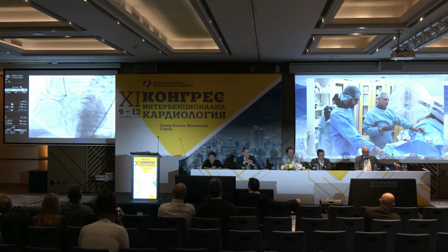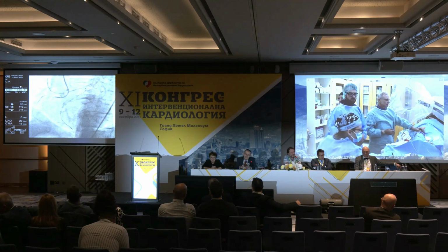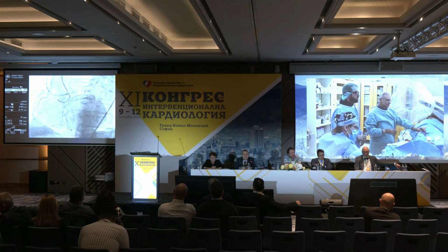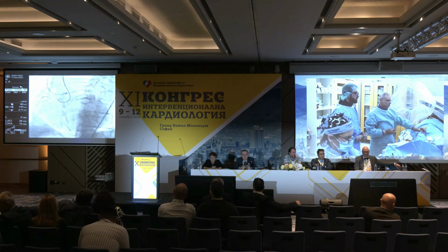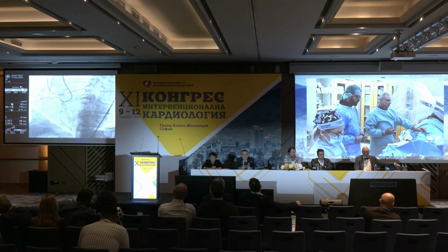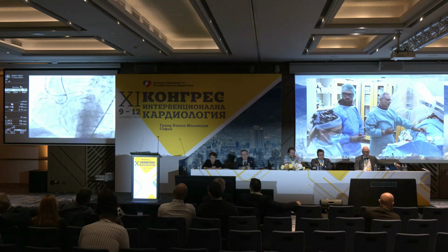People are rushing, give me a snare, give me this, give me that. As you see, you align the devices, you do it nicely. The movements here are sub-millimeter. That's the key point, that you have to do very fine movements. Control yourself, not to rush. You see here, we tried one more time. I could have pulled back the microcatheter and then run into problems. You do the correction a little bit. You work mainly on the guiding and less on the wire.